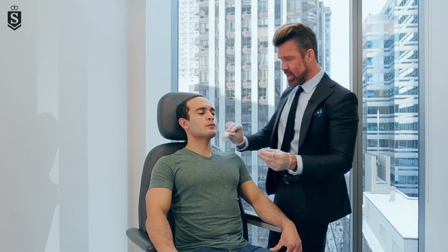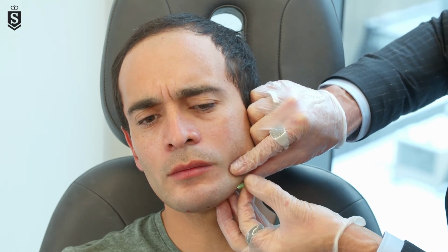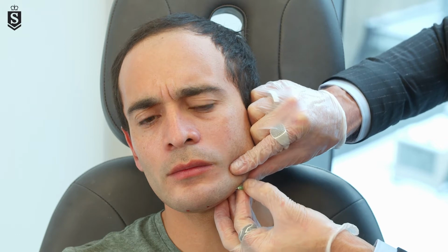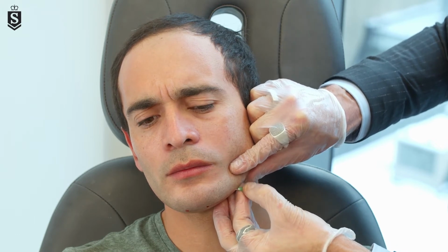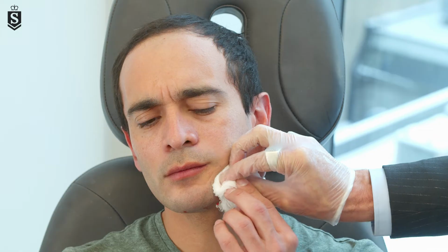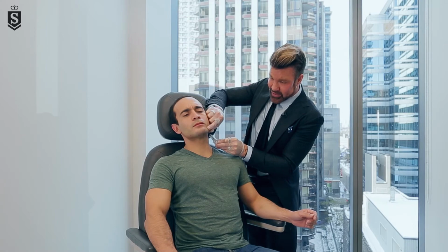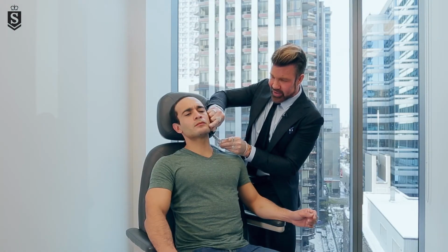Next, I'm going to use the same product, but I'm going to use a cannula, and I'm going to go, turn your head just a little bit more laterally, just slightly behind the mandibular ligament. So this is a trocar. This is really going to again enhance his anterior jawline. I'll just hold that for just a moment. And this is nice also because with the cannula, you don't get bruising, or a much lower risk of that. I'm just able to feather it in.